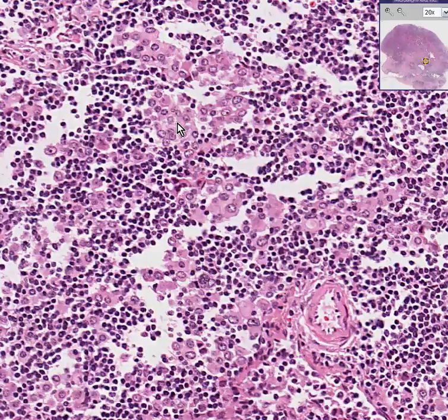You could see areas of normal lymph node architecture perhaps being effaced by little groups of metastatic cells coming in, but the opposite is true in lymphomas. In lymphomas, they're almost always 100% effaced. And it doesn't matter if this was breast carcinoma. I could tell you it was any adenocarcinoma. You'd probably believe me. And so would anybody else, because all you could say is these cells are malignant.